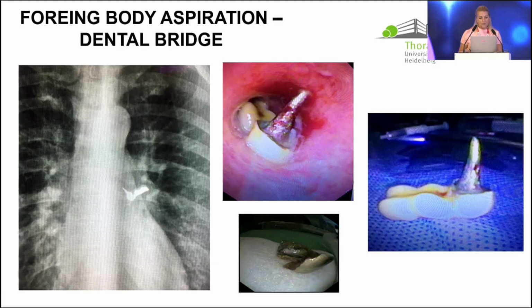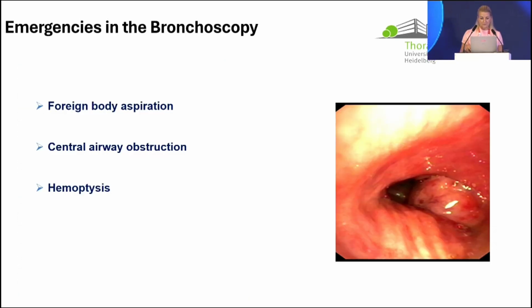This is another foreign body, a dental bridge. And if you can appreciate here in the X-ray, it's really sitting very dangerously. The patient was coughing all the time. We have to remove it immediately and hope that it will not perforate the wall there.